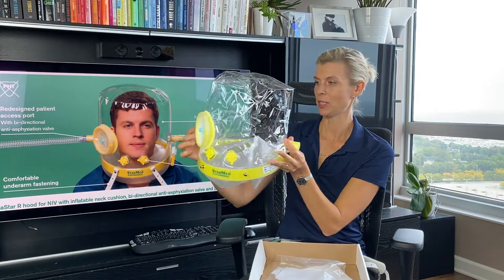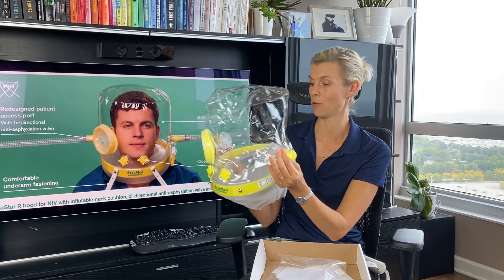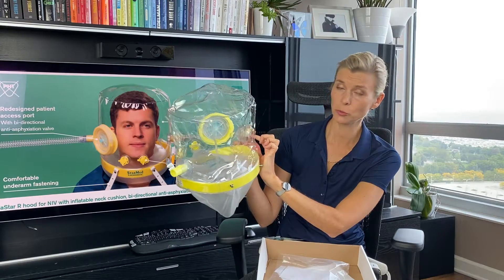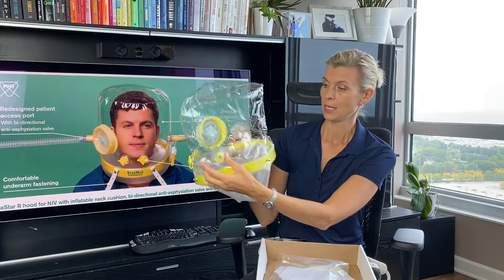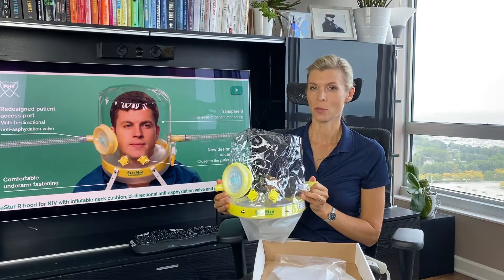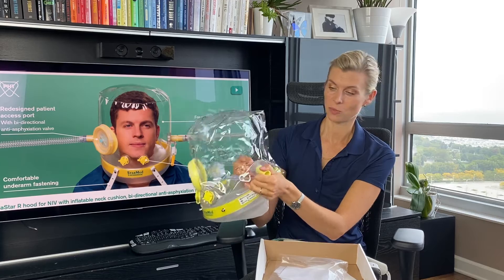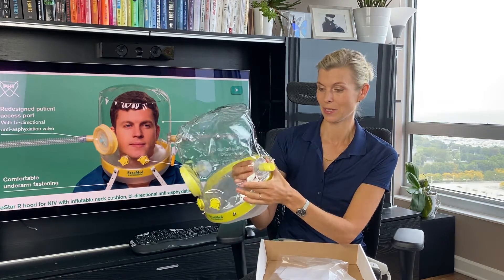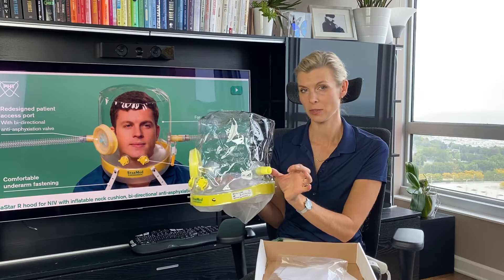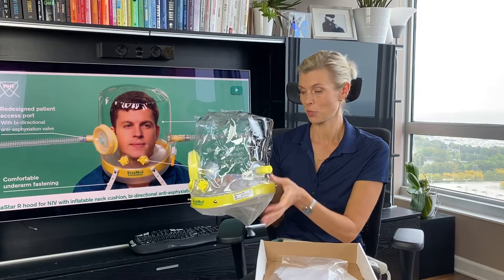You have inlet and outlet ports. It doesn't matter which you choose for the air input or which one you choose for your PEEP valve and filter. They are designed to reduce the noise in the helmet. I had a chance to talk with one of the bioengineers from StarMet and he explained how these ports were designed to minimize the noise in the hood. If it's still noisy, you can apply another viral filter on the port and that will reduce the noise in the helmet.